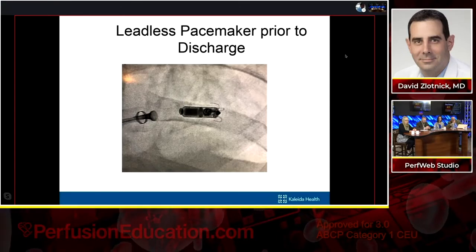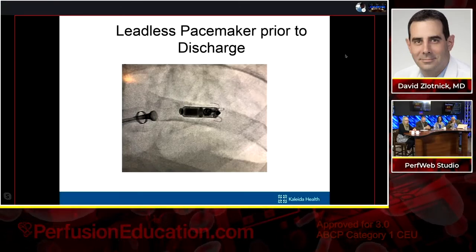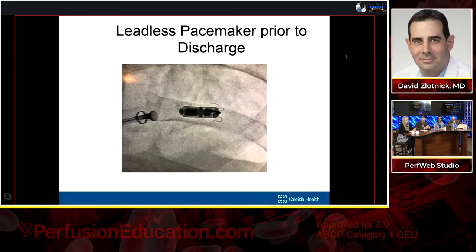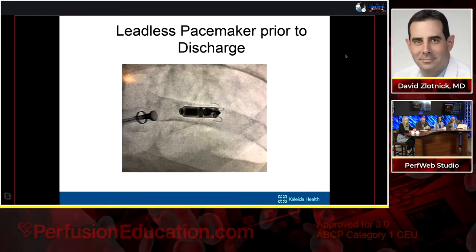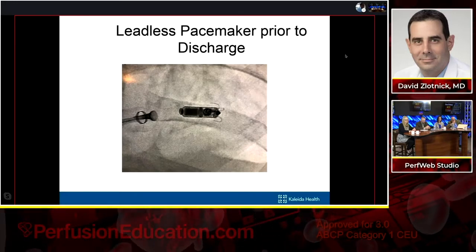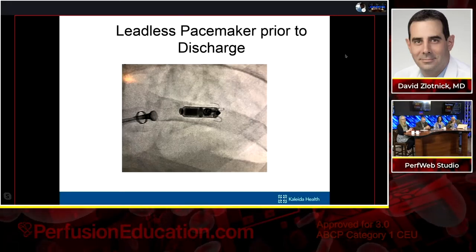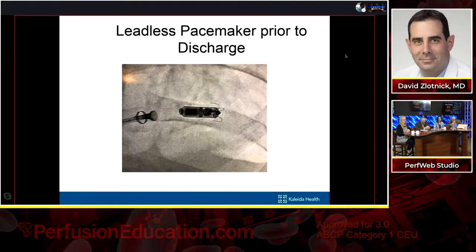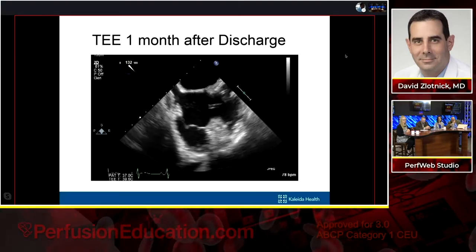And so he was treated with 4 weeks of IV antibiotics, and then one of my EP colleagues put in a leadless pacemaker, which is what we're seeing here, because his pacemaking requirements were only about 7% of the time. And this was 4 weeks later, and before she put it in, she did a TEE, and this is what the right atrial wall looked like. Basically completely normal.